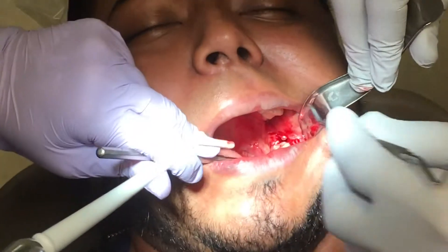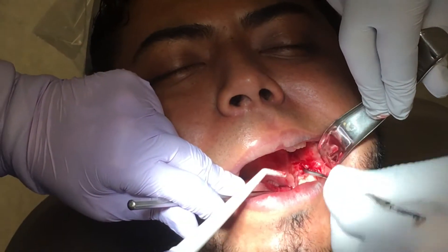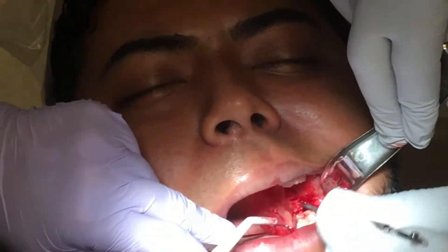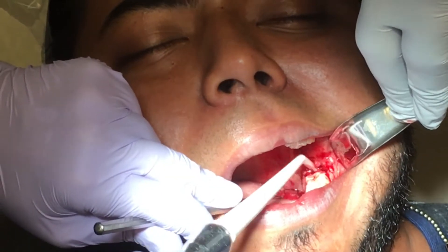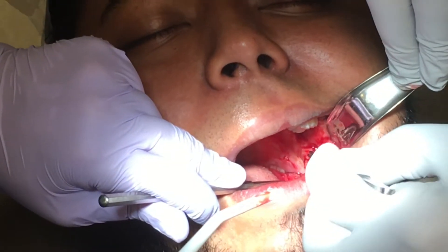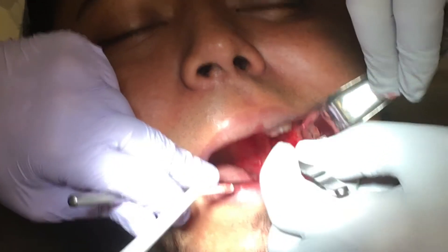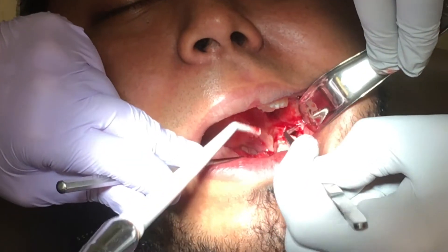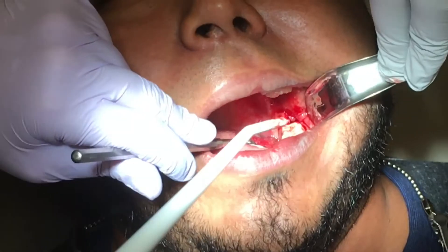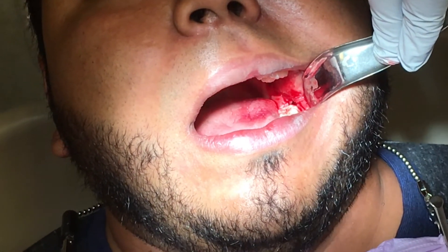We're going to continue to clean this site and make sure we get the periodontal ligament out. I do believe there might be a little bit more scar tissue in here. Go ahead and give me the other — I'm gonna put the ozone gas in next.